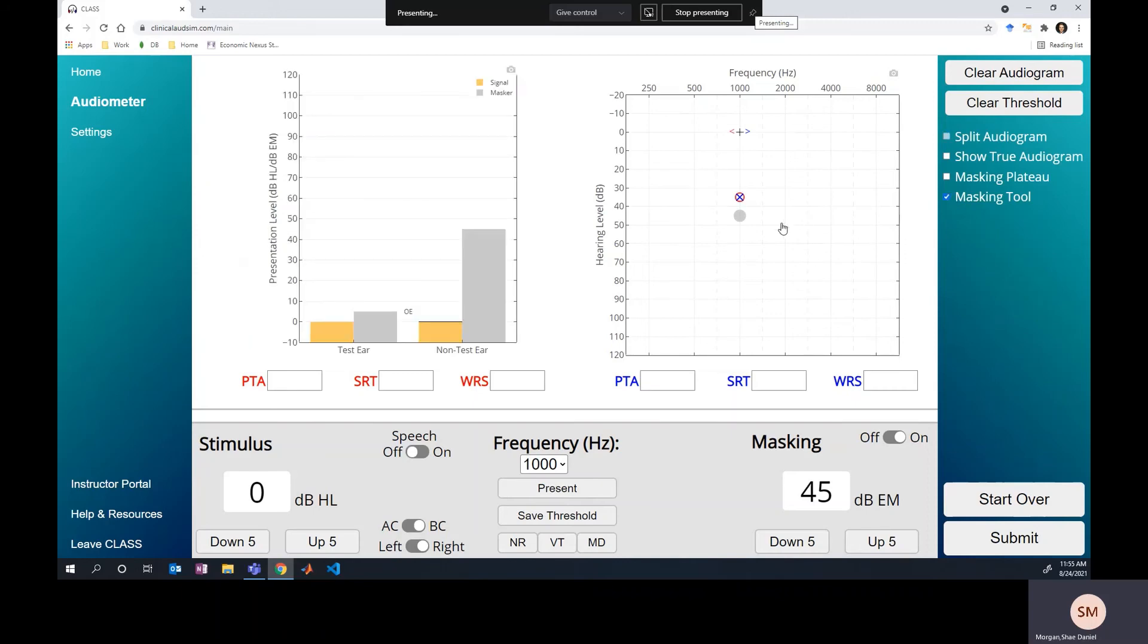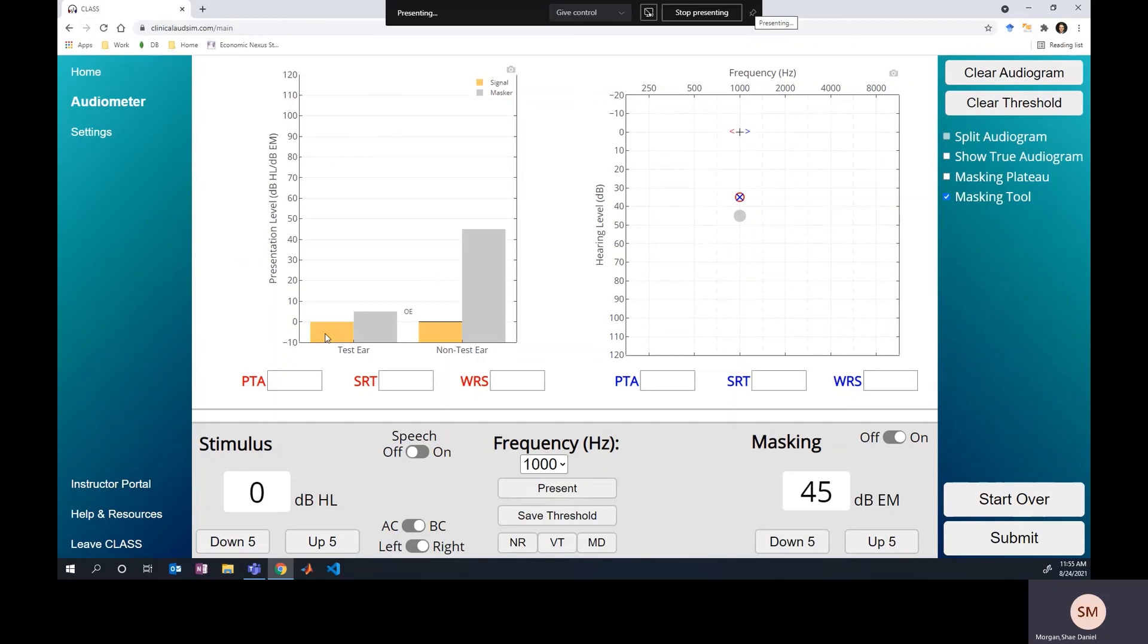With the masking tool turned on, you can see that the level of the masker is so high that it's actually crossing over and covering up the stimulus level that we're presenting. So if we present here, of course, we're not going to hear it, not because we're not at the true threshold. In fact, we are at the true threshold for this case, but we couldn't ever truly mask to find that out because the masking that's crossing over is so loud that it's already covering up the signal.